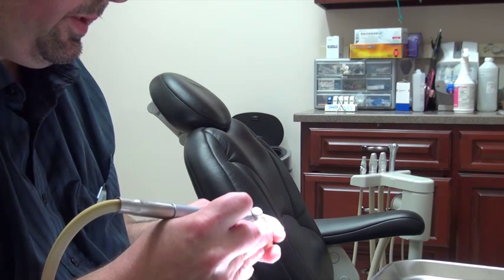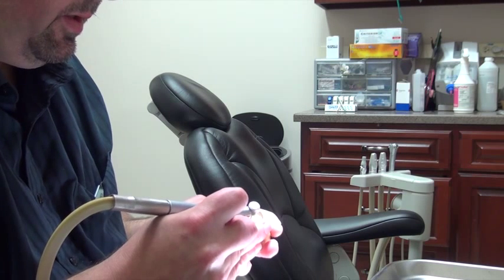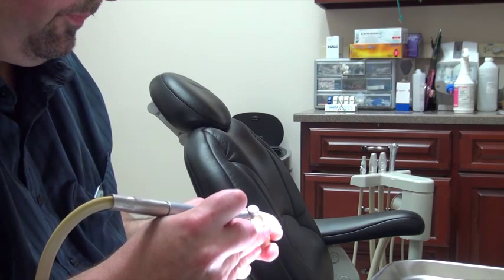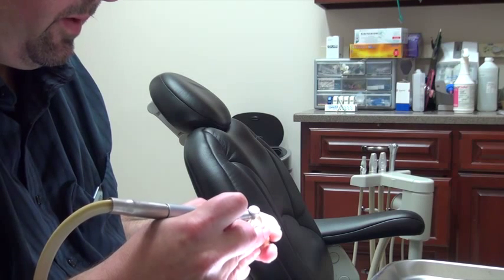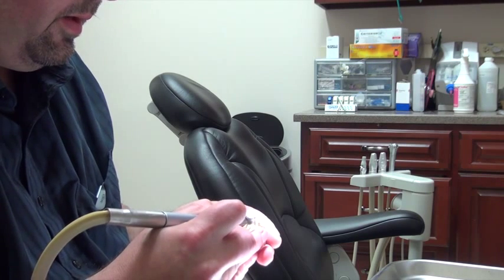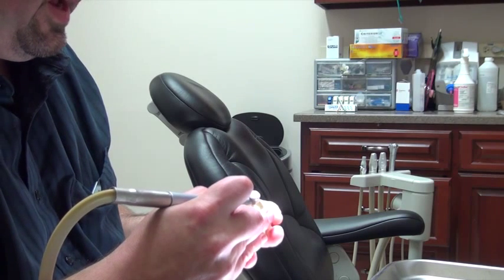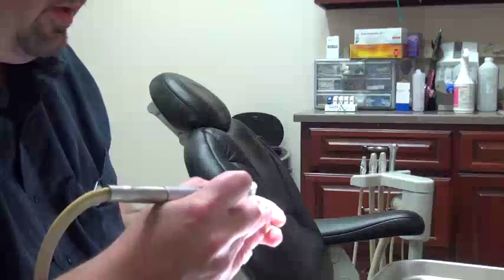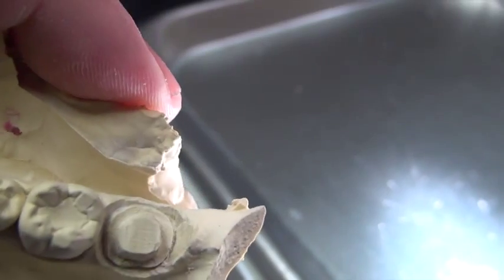The first thing we do is ditch the die. I can cut around the very edge of the margin of the crown, pulling it away from the tissue or the stone so that we can scan it into the machine to ensure very accurate margins on the crown. That's what I'm doing first — to see that we have a nice margin all the way around the crown.